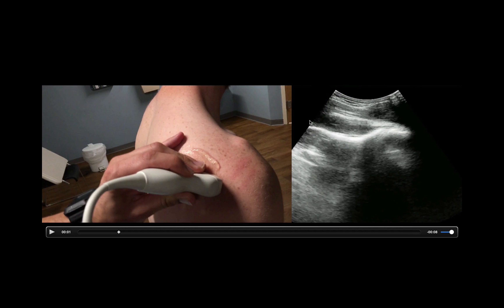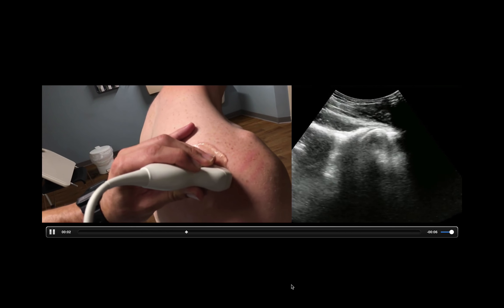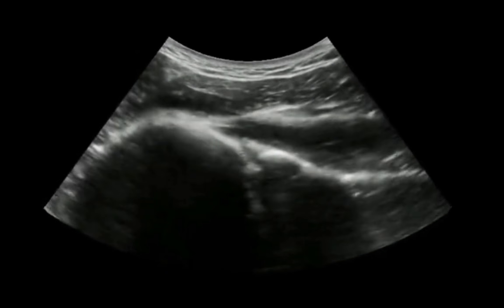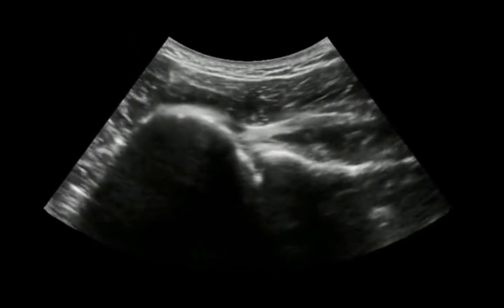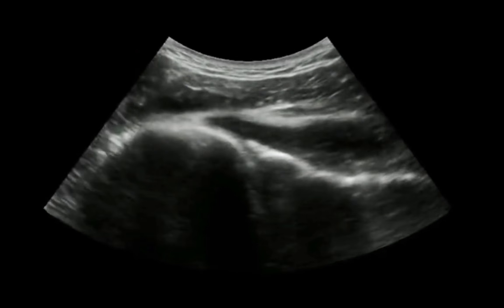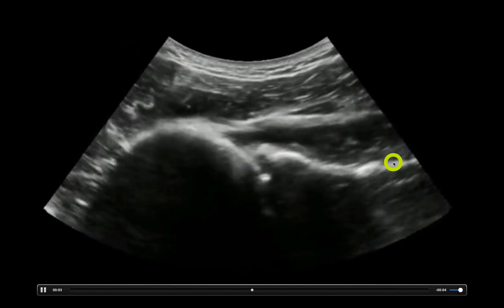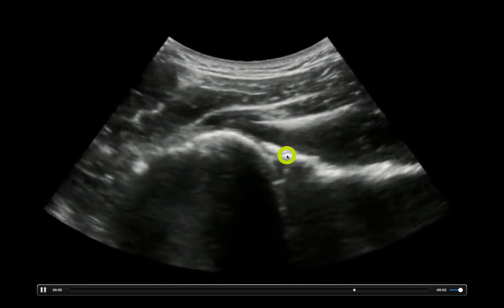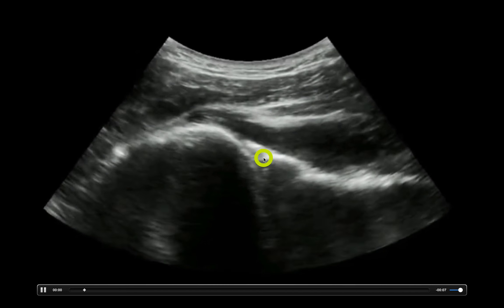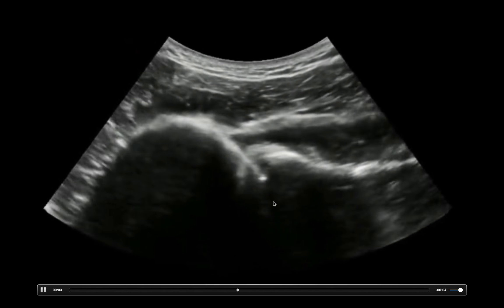You want to identify basically two main structures. You want to identify your scapula with your glenoid, and then right here, this cortex is going to be the humeral head. I can see this humeral head right in the glenohumeral joint, right where it should be. You can have the patient externally rotate and internally rotate the arm and see it move right in that glenohumeral joint. This is the humeral head in the glenohumeral joint — this is the scapula, this is the glenoid. This is not a shoulder dislocation.